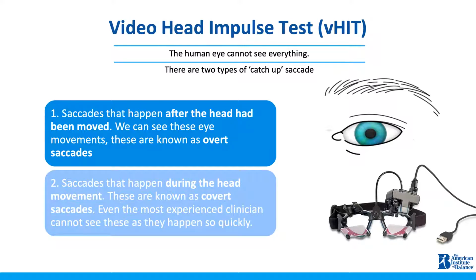When a unilateral vestibulopathy occurs, the VOR of that side of lesion becomes dysfunctional. Once this happens, the brain begins to compensate. Compensation is the brain's ability to undergo neuroplastic changes to reduce the effects that asymmetric neural firing has on the brain, which can present as blurred vision during head rotation, called oscillopsia.